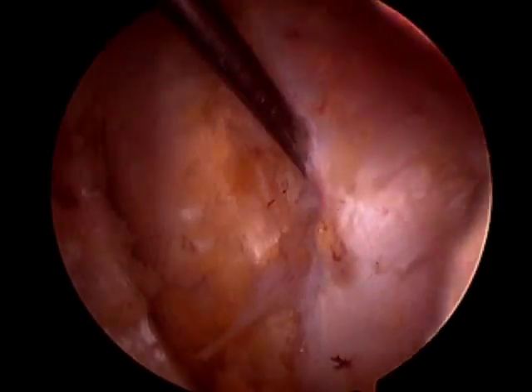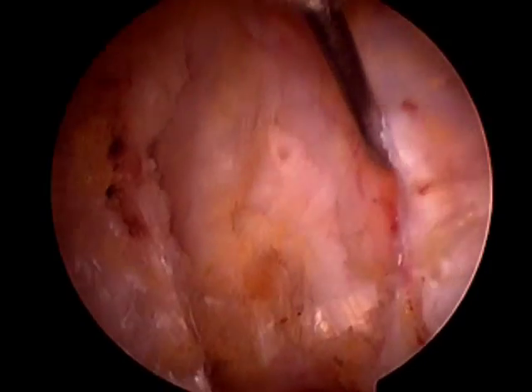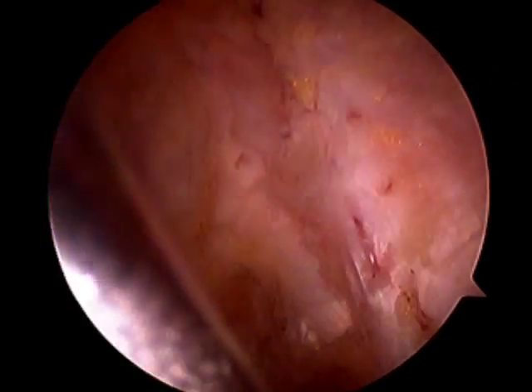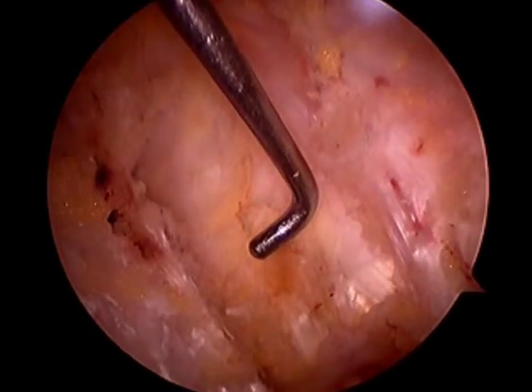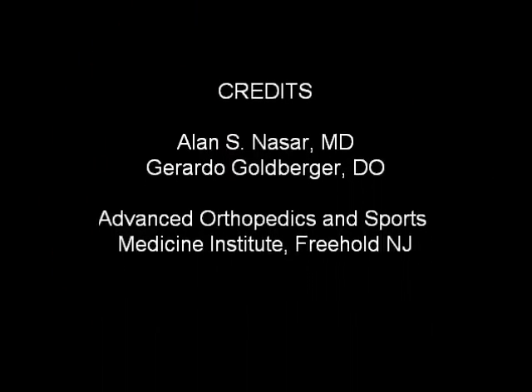There's no tension on the fascial tissue at this point. That concludes the narration of arthroscopic trochanteric bursa excision with fascia release, performed by Dr. Goldberger and myself. Thank you.